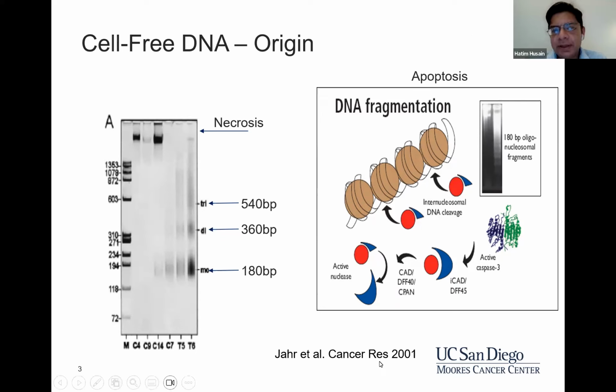The field of cell-free DNA is not necessarily a new one, but in the world of cancer, I think what has moved the field forward is technologies that can identify somatic mutations and other genomic alterations in smaller fragments than what can be conventionally done with next-generation sequencing.